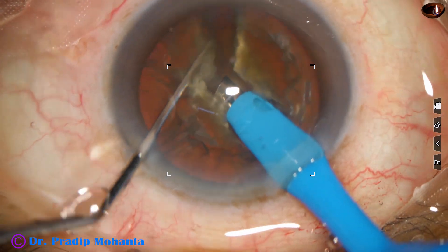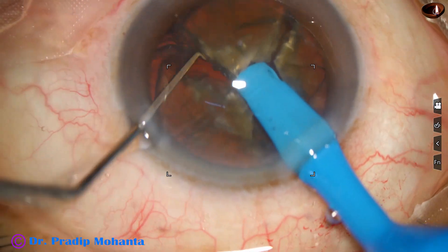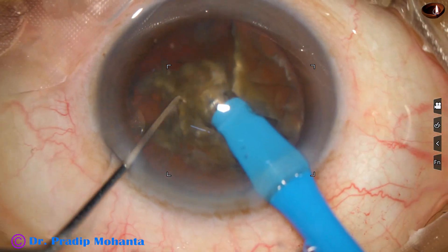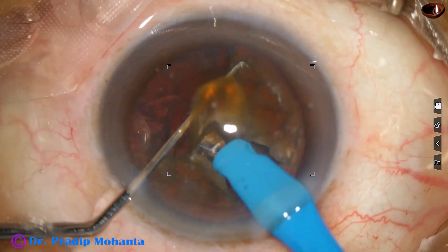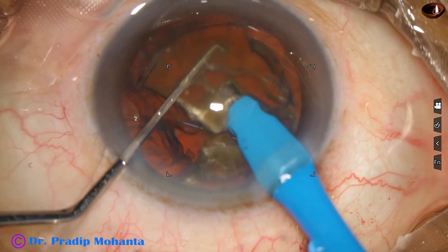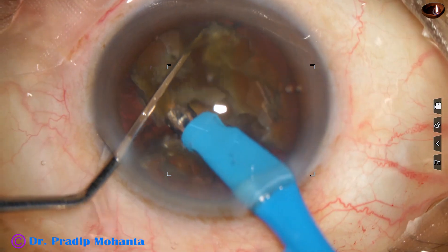I do not do a lot of lateral separation. Another chop here. In this case, I did not rotate it 180 degrees because I did not rotate the nucleus before introducing the phaco needle, since the cataract appeared like a posterior polar cataract. So I get a piece and emulsify it. And now the nucleus is rotating — hydrodissection has occurred nicely by this time — and I emulsify this piece.